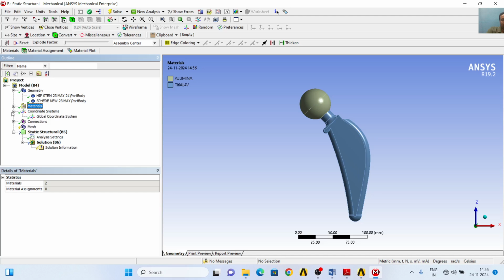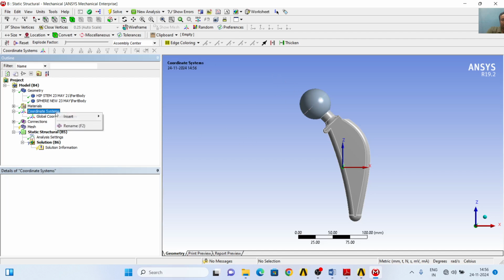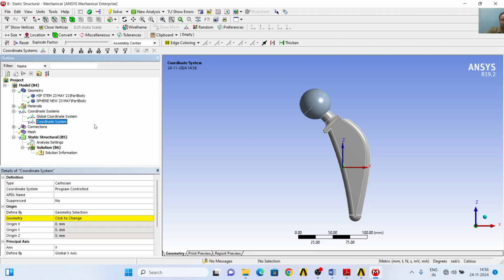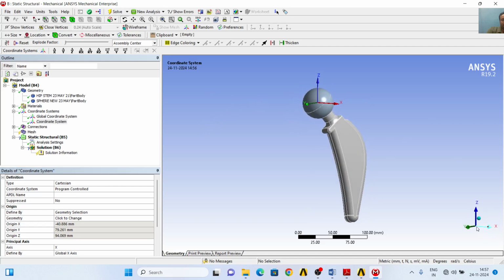I will create another coordinate system. You can see that this is the coordinate system here, and I will have to apply the forces here. So I will create an additional coordinate system, and I will select the geometry, this sphere, and apply. And now you can see that there is another coordinate system for applying the forces in x, y and z.